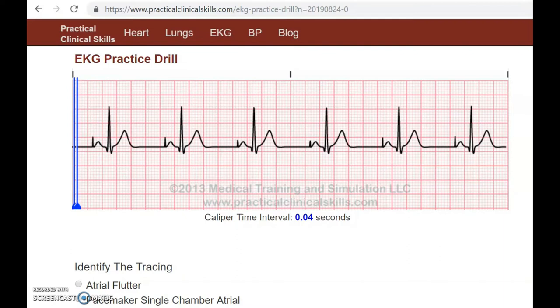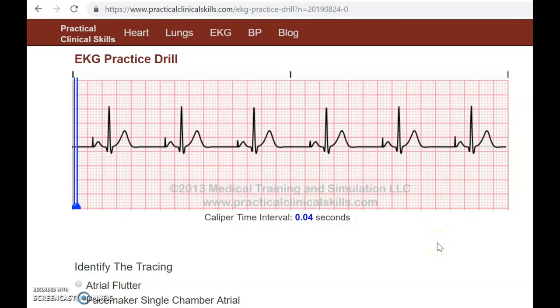Hey guys, welcome back, it's Kay, and today I have another EKG practice strip for you. Overall when we look at this strip we see these weird spikes everywhere. When we see this, the first thing that should come to your mind is that we have a pacemaker. When you look at your monitors you're going to see spikes everywhere when there's a pacemaker, and sometimes you don't see the spike and then they'll just pop up out of nowhere — that's a demand pacemaker.